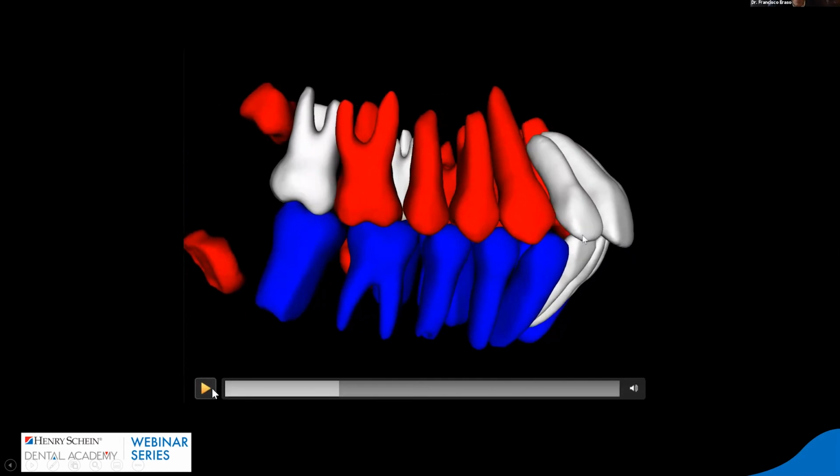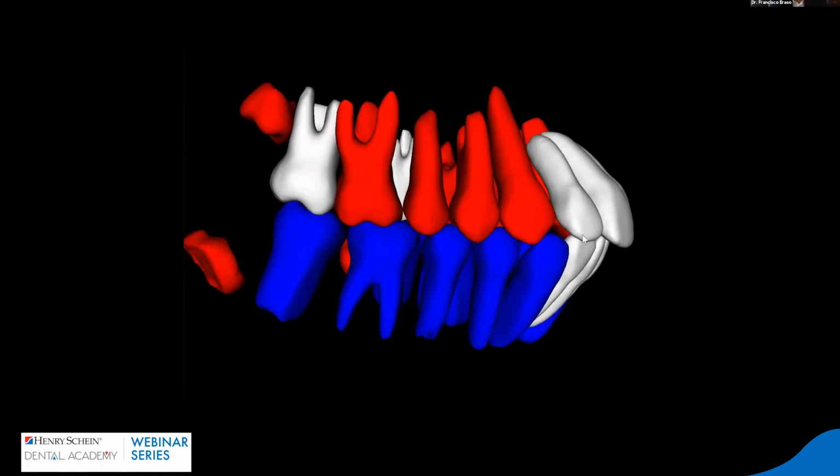The problem here is this, okay? In this case, and this opened my eyes for this case. Look at how much flaring of the upper and the lower incisors. Very difficult to correct that class 2 in this case without correcting the habit, okay? The reason why the patient has those teeth so flared is because she was trying to breathe. Remember, the airway spaces were 13 millimeters square, and that is very constricted for anybody, especially for a 13-year-old, who is almost 6 feet tall, okay? She was not sleeping well, and of course, she was trying to breathe by positioning the tongue forward.